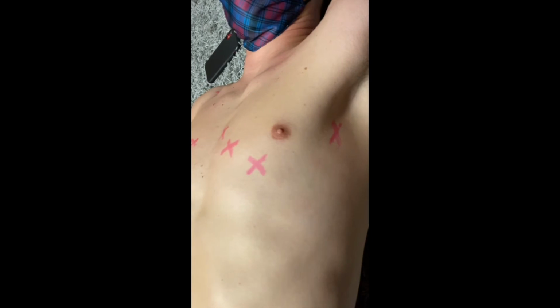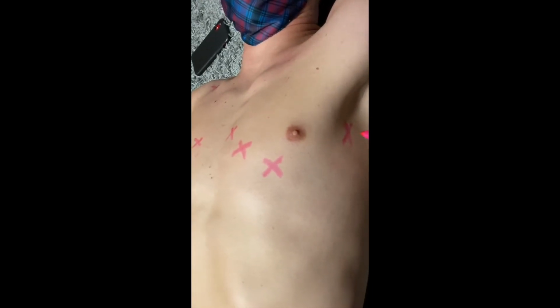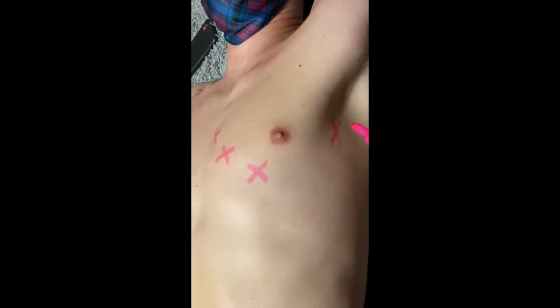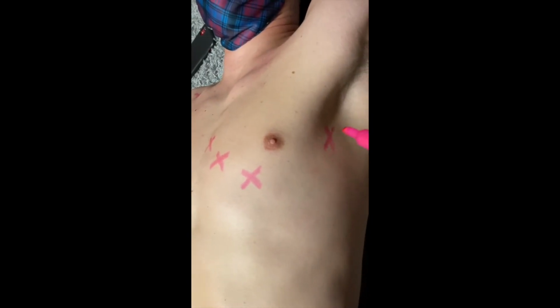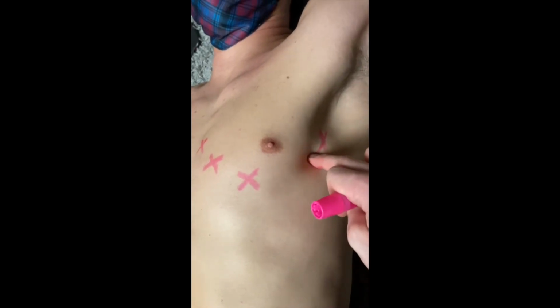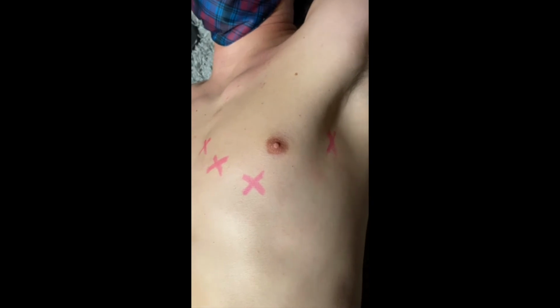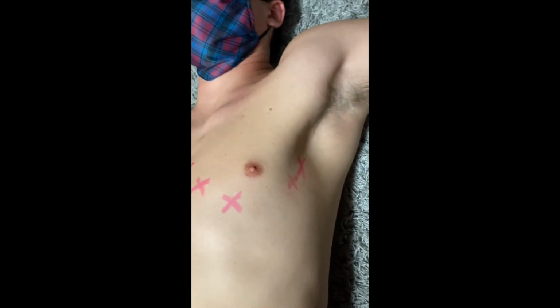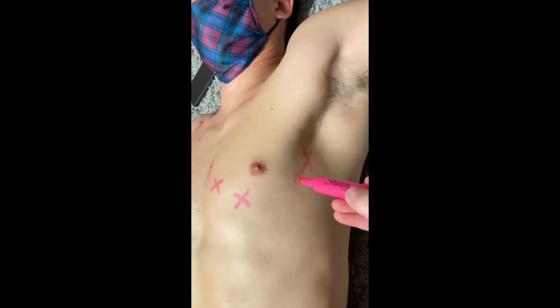Okay, so now for the last one, for V6, it's in the mid-axillary line, so it'd be right in the middle of the armpit. And as Josh has moved his arm a little bit here, you can see this one kind of got dragged out a little bit for V5. So I'm gonna maybe ignore that and reevaluate. I should put it like right there, just a little bit down, because that's like right in his armpit. Okay, so ignoring that one, focusing on that, that's V5.